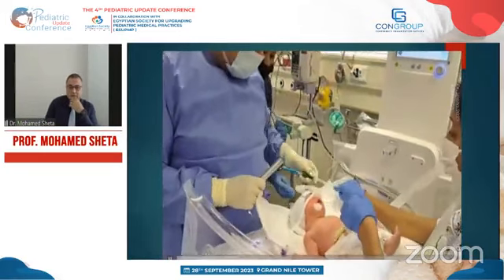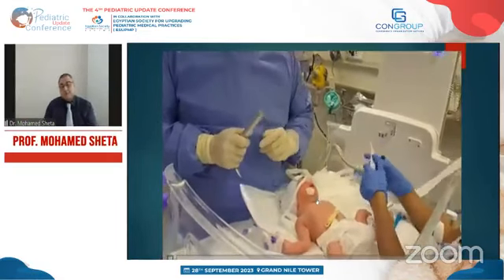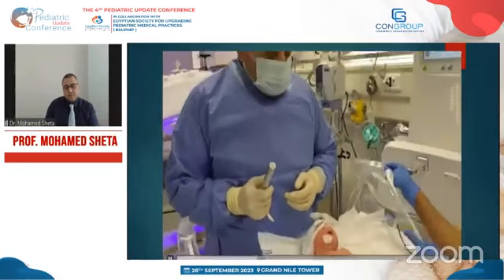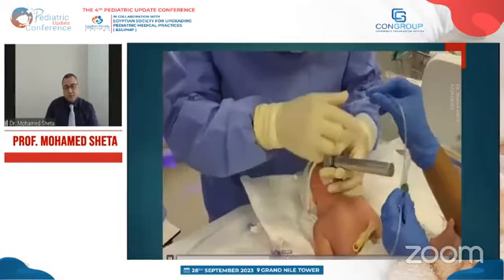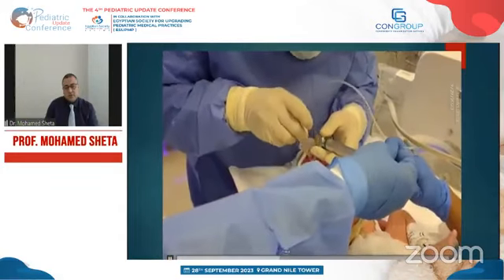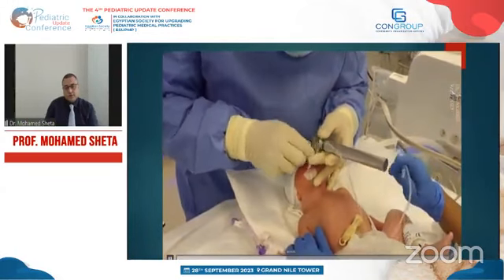Suctioning is here, and it's ready to be used if needed, if there are secretions which obscure the view of the larynx. So this is the suction catheter. There are some secretions obscuring the view, so we'll do some suction.